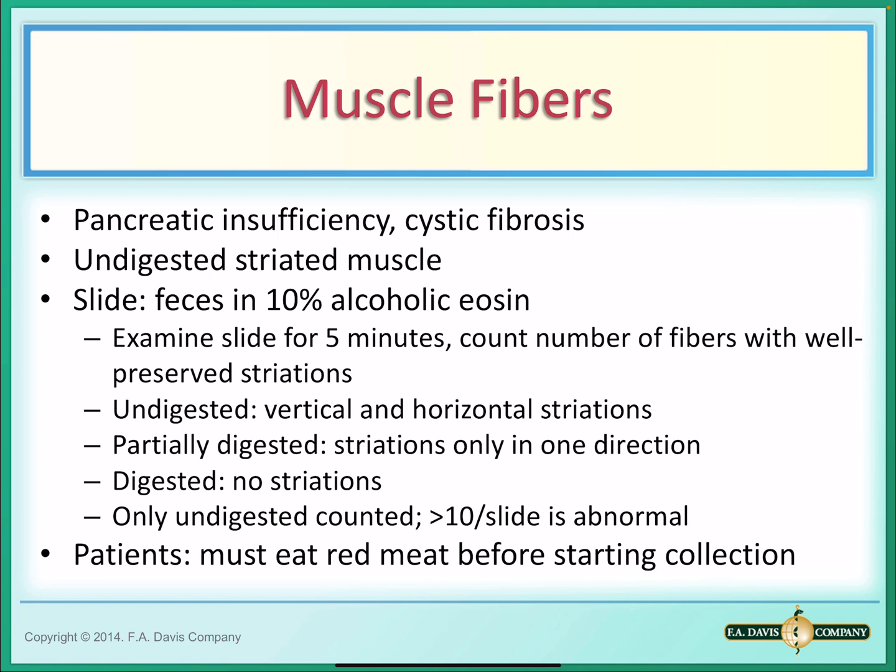To produce a representative specimen here, patients should be instructed to include red meat in their diet before collecting the specimens. Specimens should be examined within 24 hours of collection.